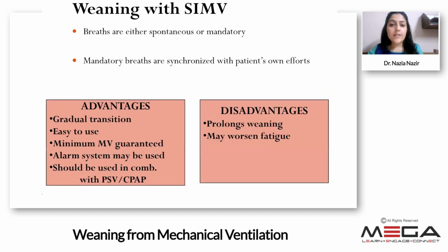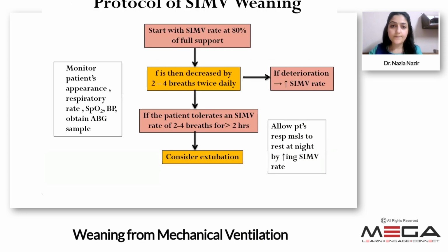Then, previously SIMV was used for weaning. However, this is not usually used now. The advantages it had were gradual transition, ease of use, a guaranteed minimum ventilation, and the presence of an alarm system. However, it worsens fatigue as well as prolongs the weaning period.